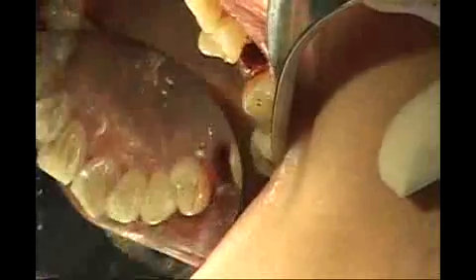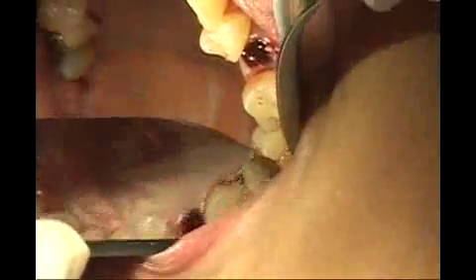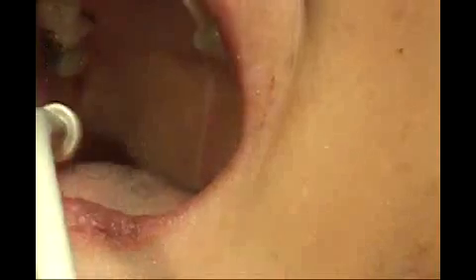So now we have the implant without any spaces on the buccal. So we have the implant. Okay, and because of how solid it was, we're going to go ahead and place the cover, a healing abutment on. We could also temporize the case, but we're going to place a healing abutment on it, one stage manner.